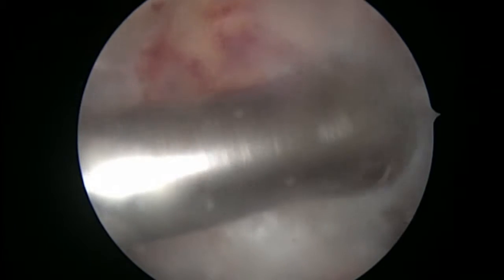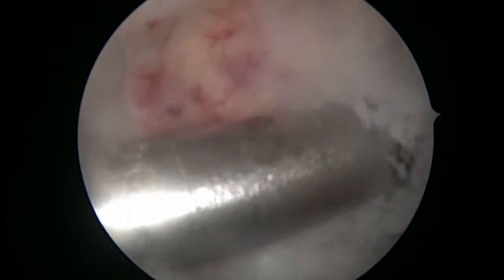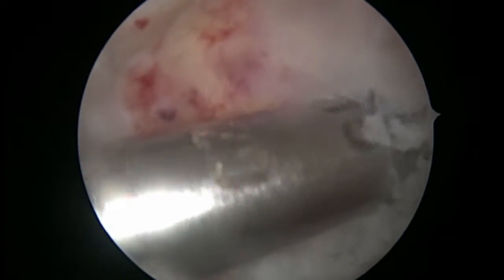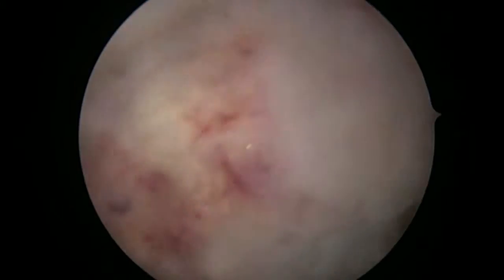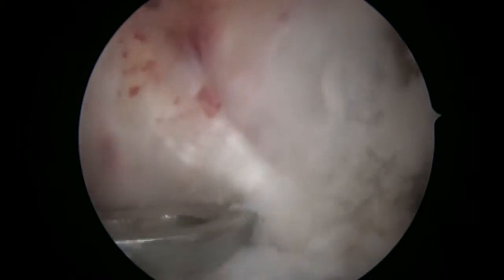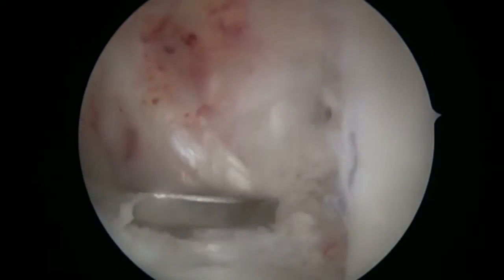We are drilling the femur to accommodate the graft. Now, after the femoral drilling is complete, we are assessing where to place our tibial drill so that we can accommodate the graft on the shin bone.